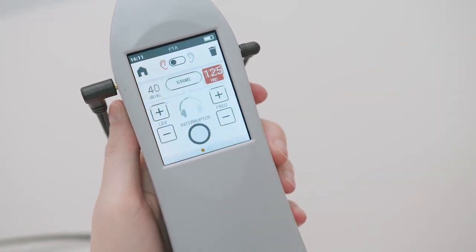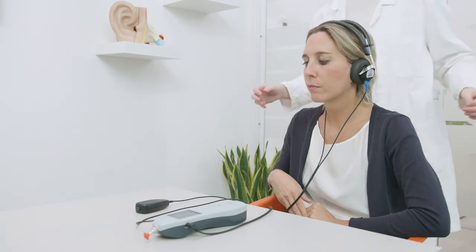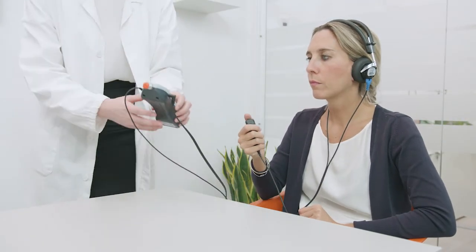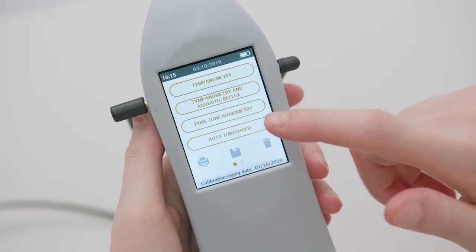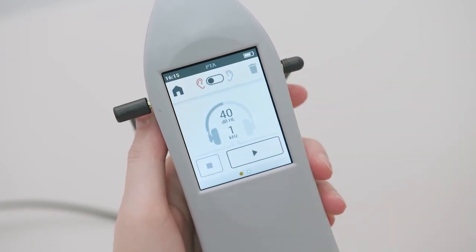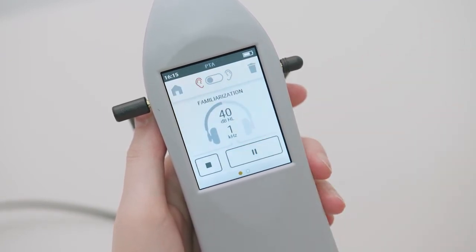Auto thresholds tonal audiometry allows you to set your hearing threshold for several frequencies through an automatic procedure. The exam is selectable from the main menu and can be started by simply pressing the play button.